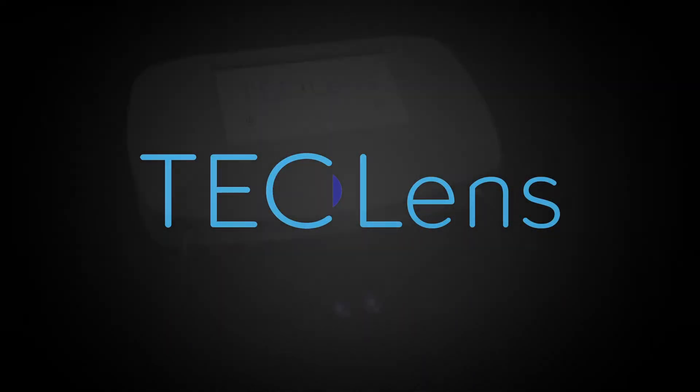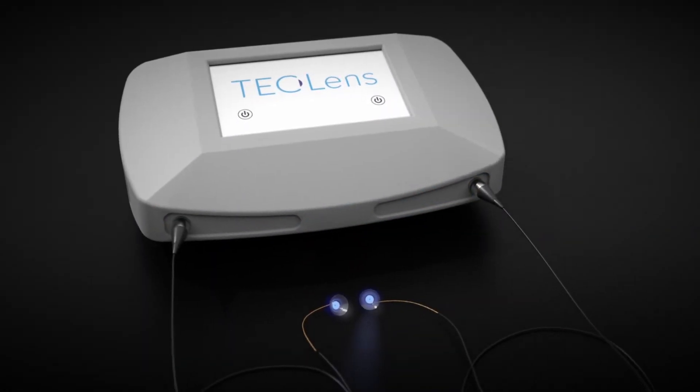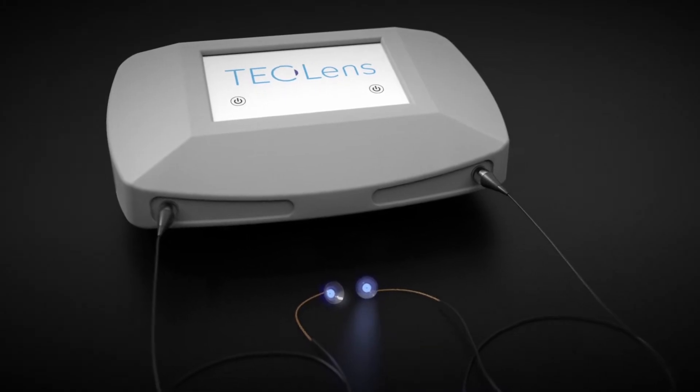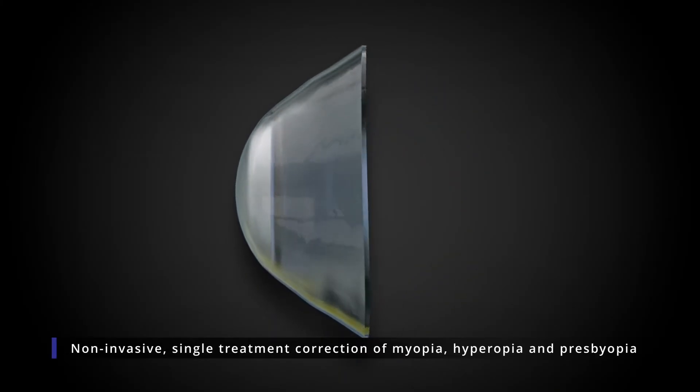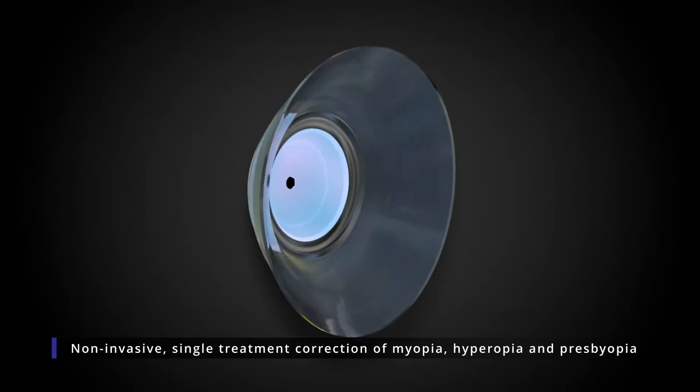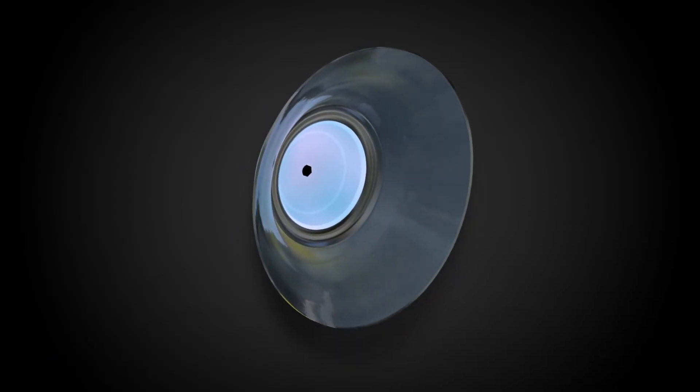TechLens has developed a non-invasive single treatment that uses light to gently strengthen and reshape your cornea, correcting nearsightedness, farsightedness, and the need for reading glasses as you get older, all without cutting or ablation.